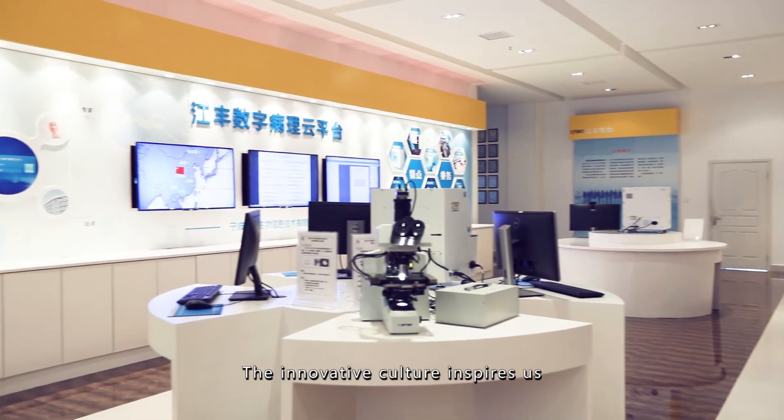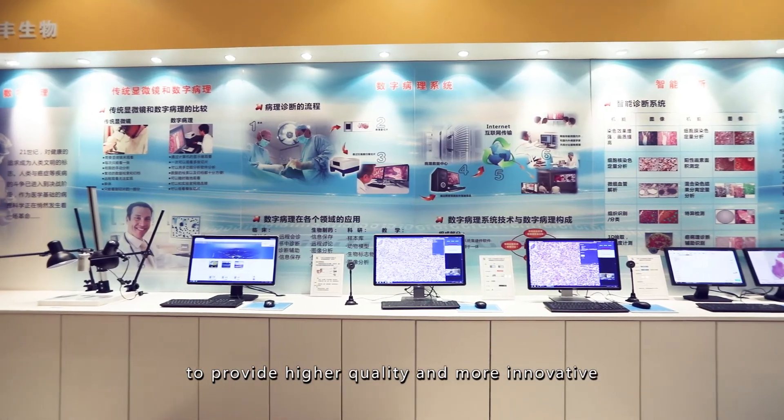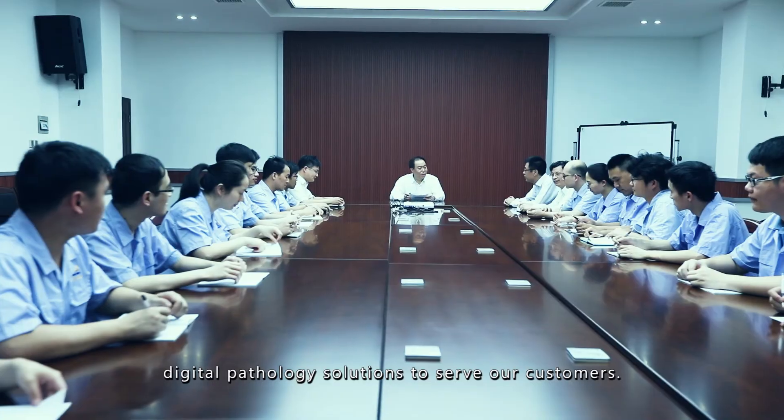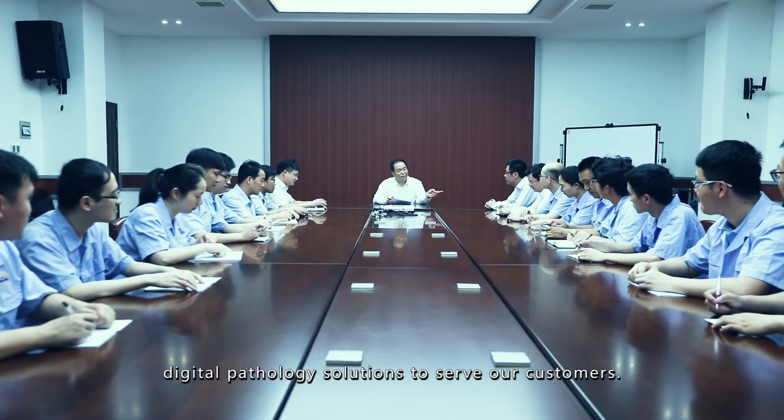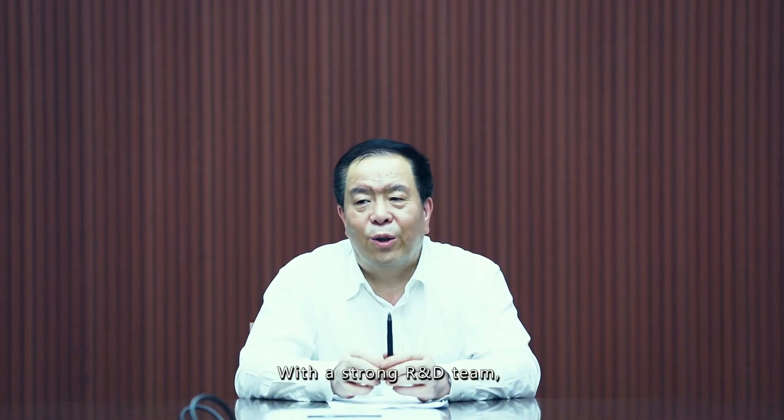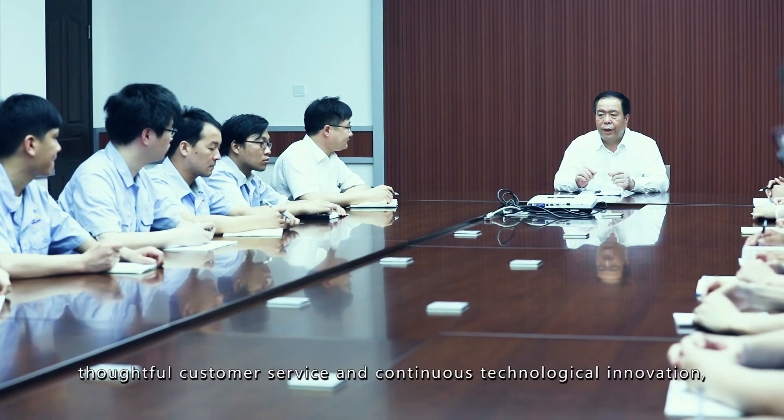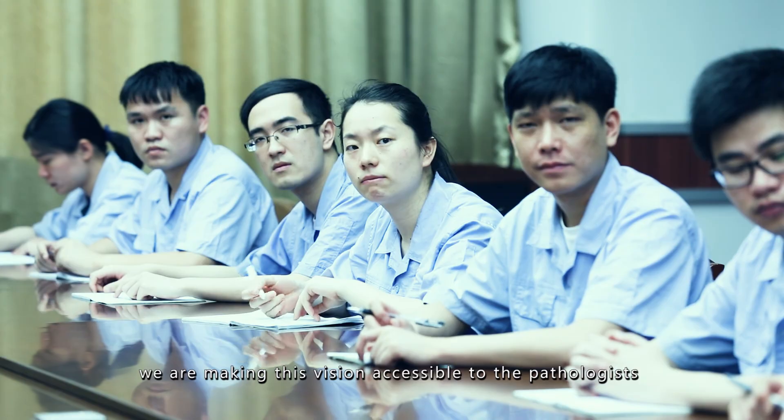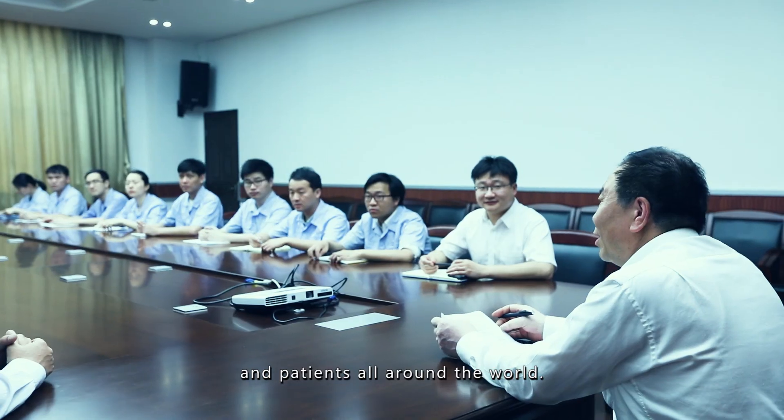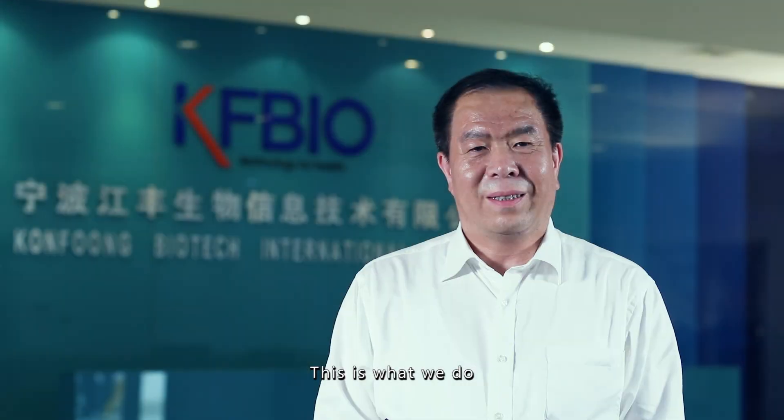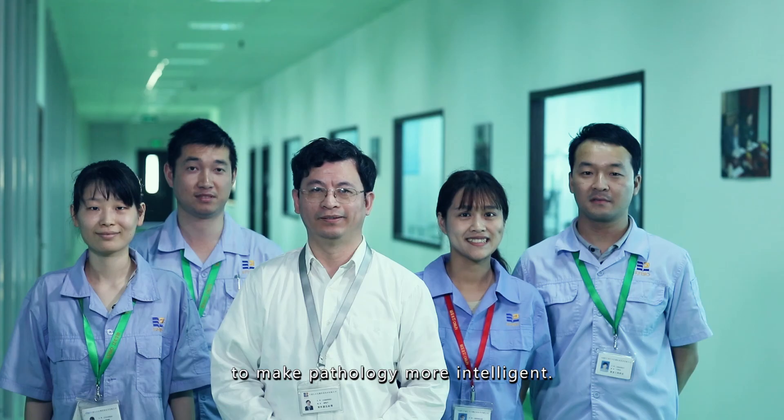The innovative culture inspires us to provide higher quality and more innovative digital pathology solutions to serve our customers. With a strong R&D team, thoughtful customer service, and continuous technological innovation, we're making this vision accessible to the pathologists and patients all around the world. This is what we do to make pathology more intelligent.